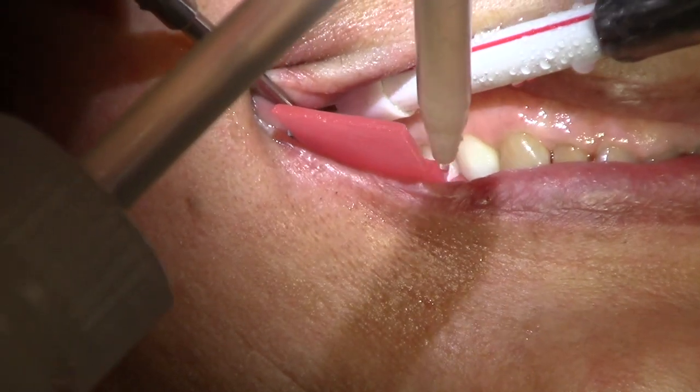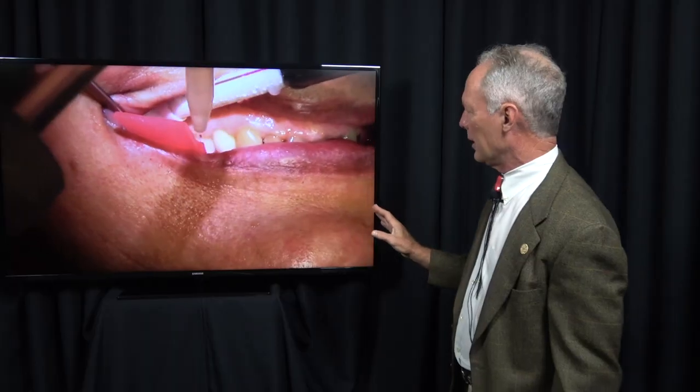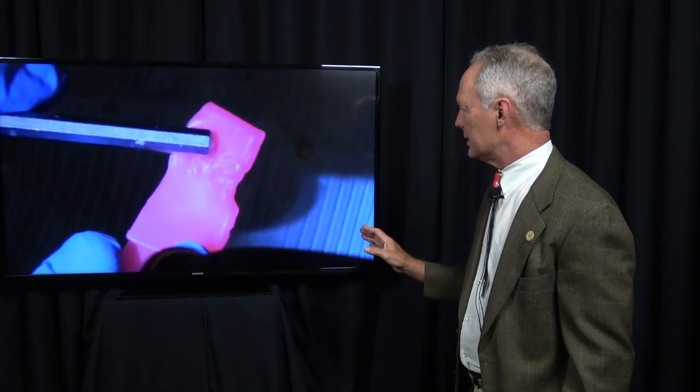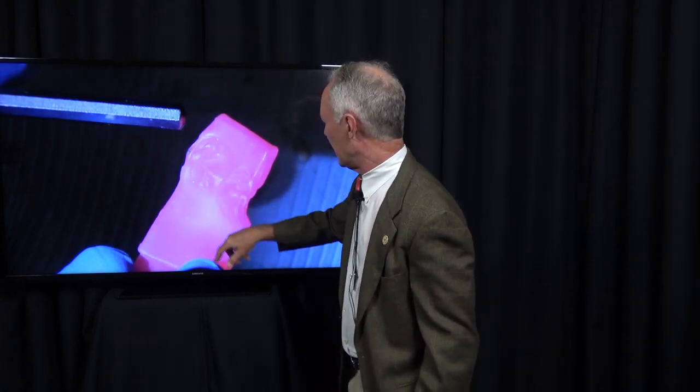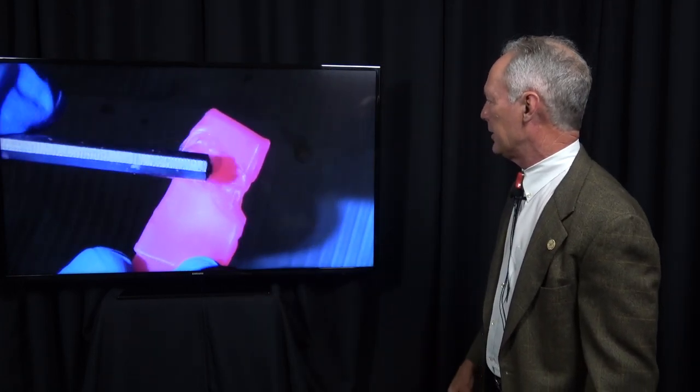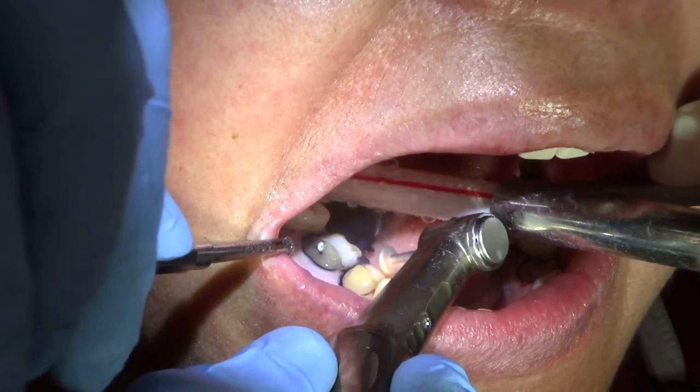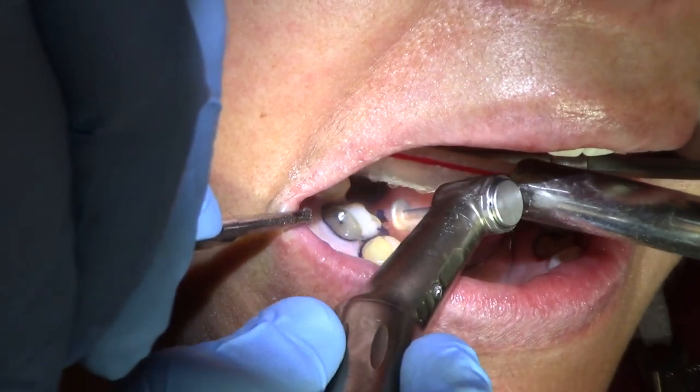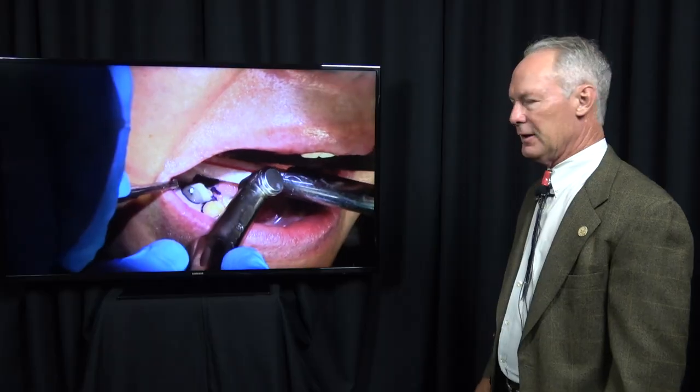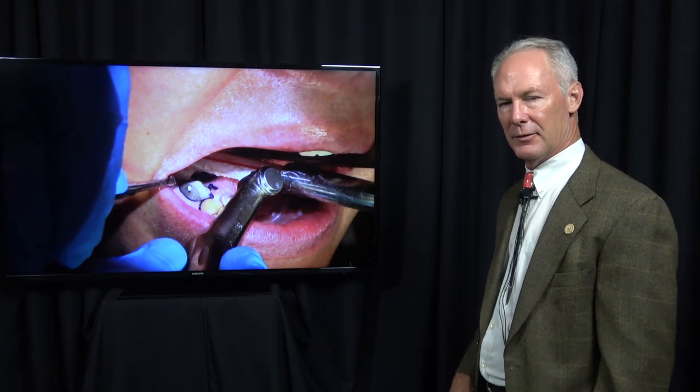Once you've done this, wash it with that ice-cold water to set it up, and you can see we've got a little thin area right there. So, I'm going to go back and prep that. There's a little thin area right there. Prep that just a little bit. So, we've got plenty of clearance. Technicians hate it when you don't have enough clearance.